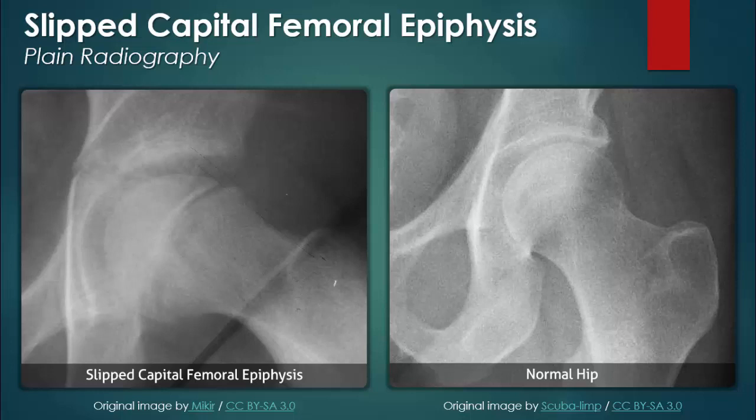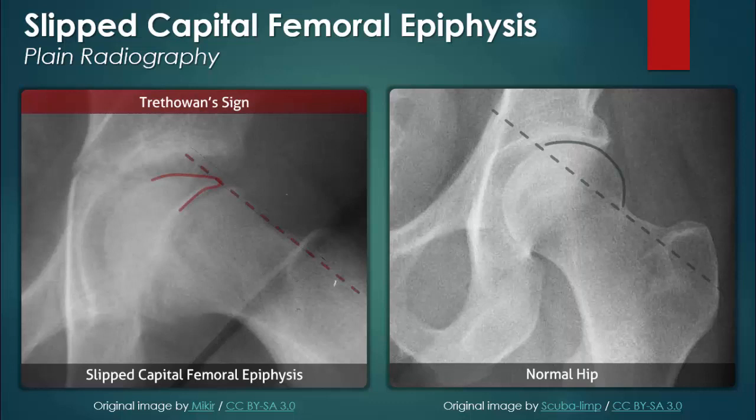The slippage in this case is not that obvious for the untrained eye. Compare it with the plain radiograph of a normal hip on the right. To help detect the abnormality, a line referred to as Klein's line is drawn along the superior edge of the femoral neck. If the hip is without pathology, the line will pass through a portion of the femoral head. A line that does not intersect the femoral head, or a line that only passes along the superior edge, is indicative of slipped capital femoral epiphysis.